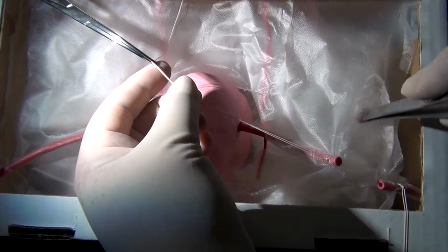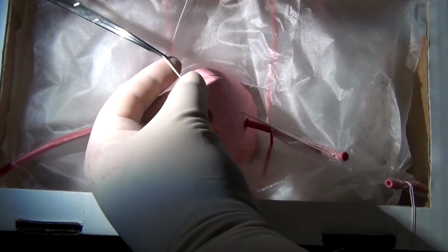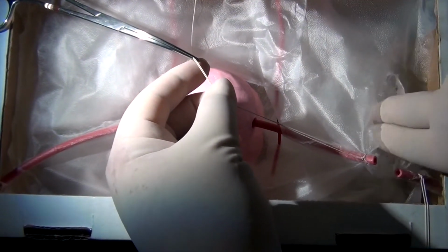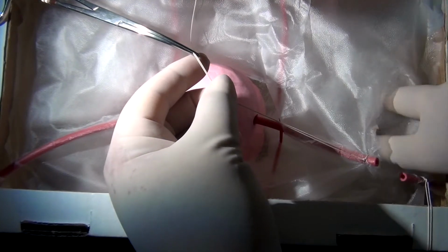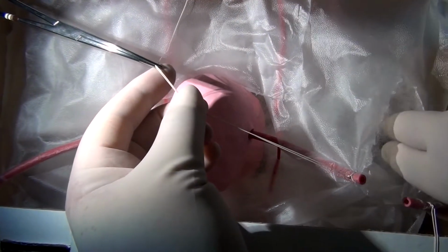We're just trying to break up the areolar tissue that you're going to find here. And deep in the pelvis are your iliac vessels. So if you do the motion of laterally spreading, but parallel to what would be your hypogastric, your external iliac vessels, then you won't get into trouble. This is usually an avascular space.